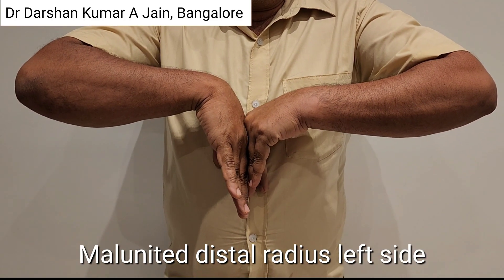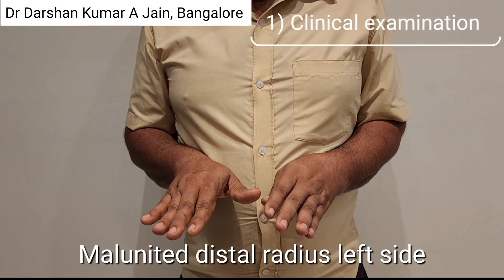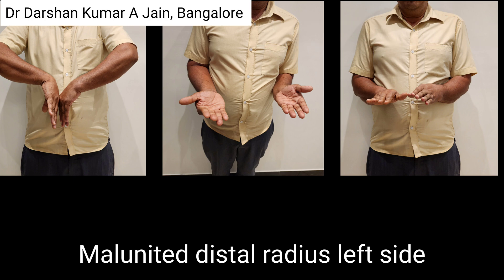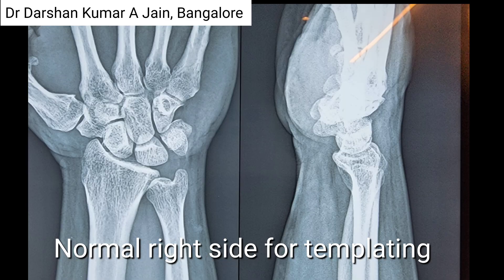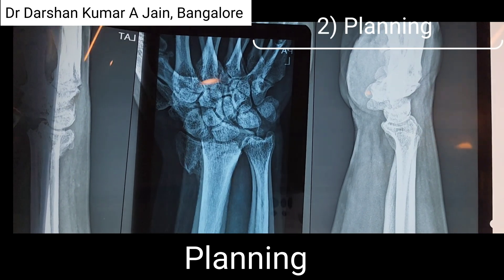Here are the five points to get excellent results for a malunited distal radius fracture. The first point is clinical examination showing loss of dorsiflexion and rotations. A crooked wrist is obvious on the left side. You can see the palmar flexion is lost, and he has enough deformity. A good X-ray shows both the loss of angulation, height, and tilt, as well as the contralateral side for good planning.